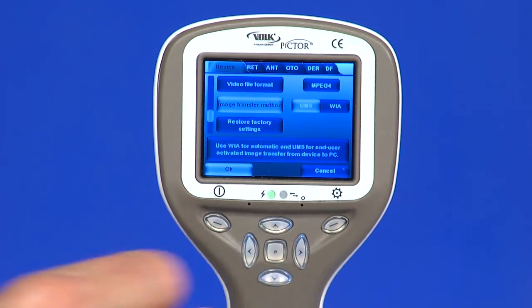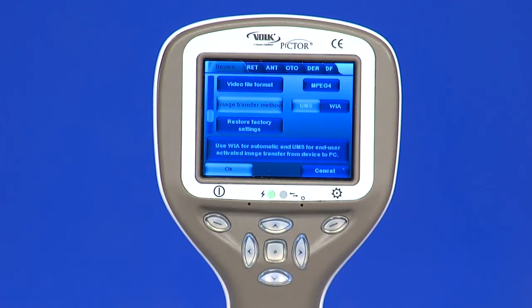Image Transfer Method: there are two options — UMS, USB Mass Storage, or WIA, Windows Image Acquisition. UMS is the standard choice.